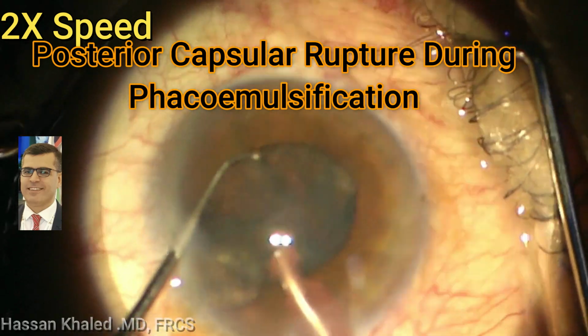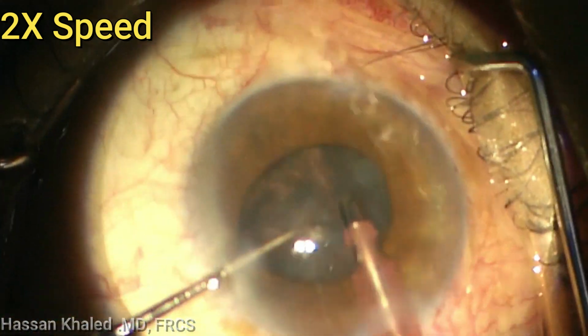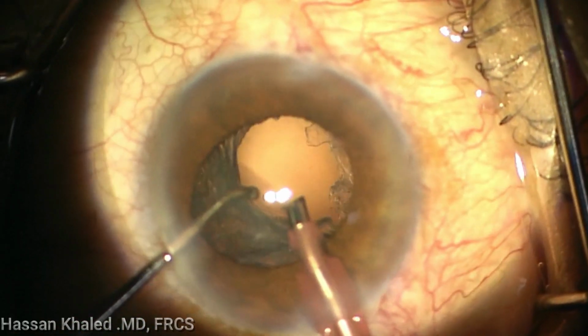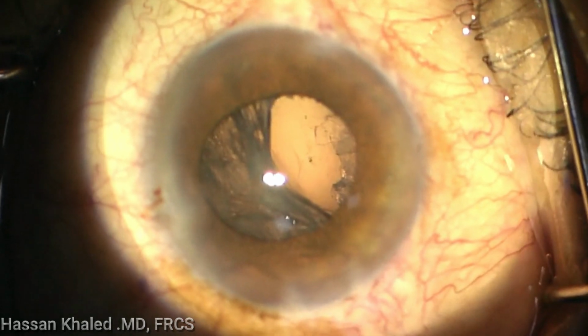Posterior capsular rupture during phacoemulsification. In this case, I'm going to show you some tips in how to deal with the posterior capsular rupture. You can see now the rupture of the posterior capsule while removing the cortex.